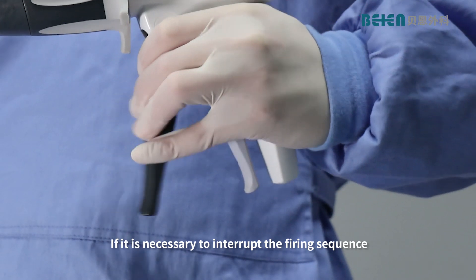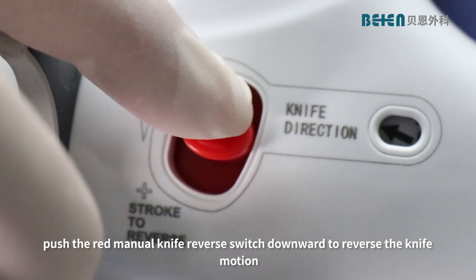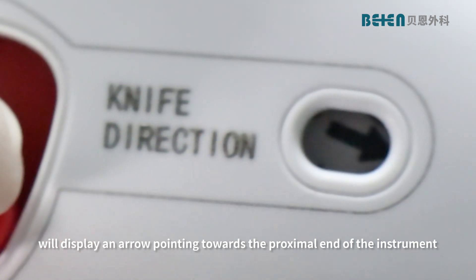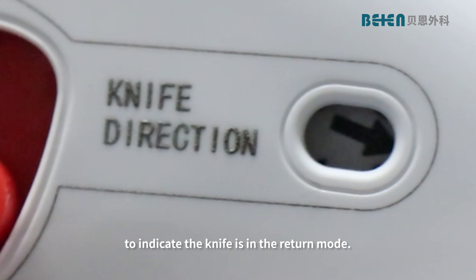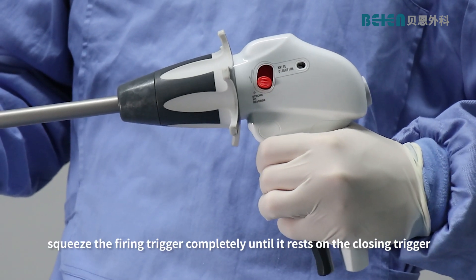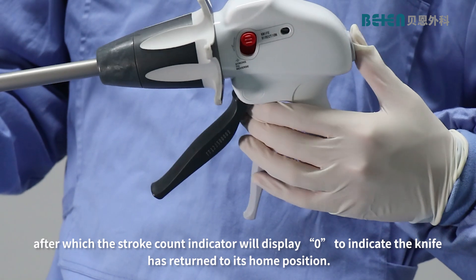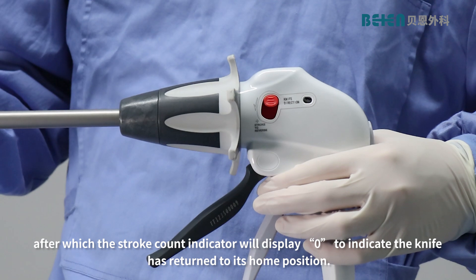Note: if it is necessary to interrupt the firing sequence, push the red manual knife reverse switch downward to reverse the knife motion. The knife direction indicator will display an arrow pointing towards the proximal end of the instrument to indicate the knife is in return mode. To complete, squeeze the firing trigger completely until it rests on the closing trigger, after which the stroke count indicator will display zero to indicate the knife has returned to its home position.